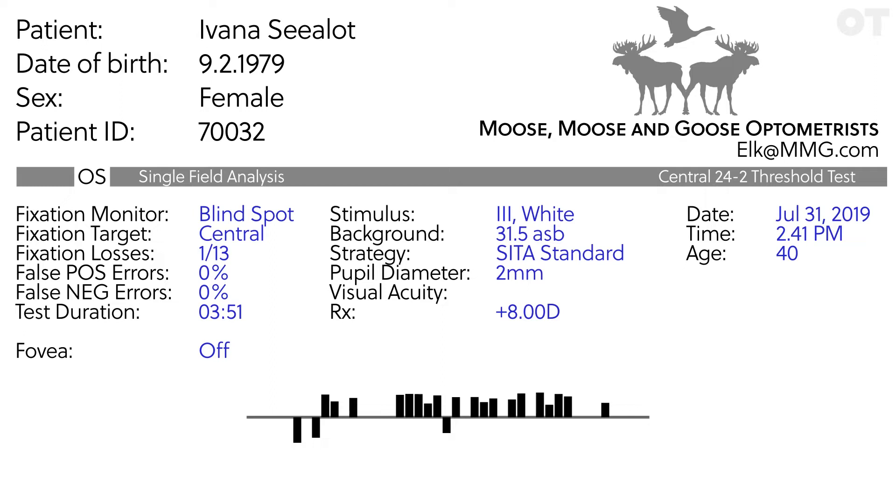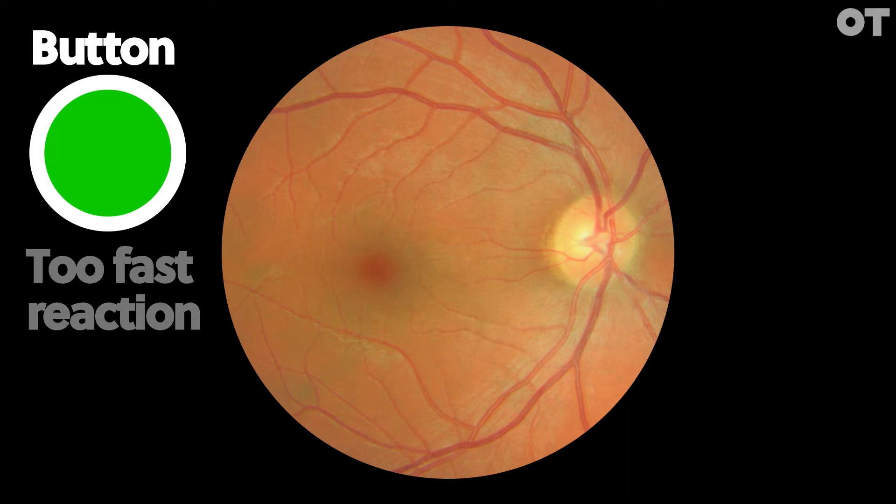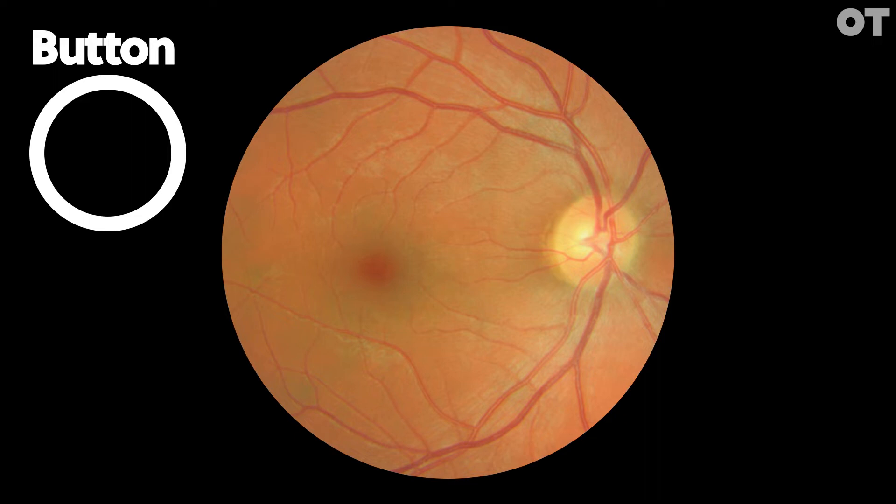A high false positive error rate indicates a trigger happy patient. The patient pressed the button when they had not seen a stimulus. The machine estimates this by counting responses made before, during or impossibly soon after a stimulus is presented. Over 15% false positives indicates an unreliable result.